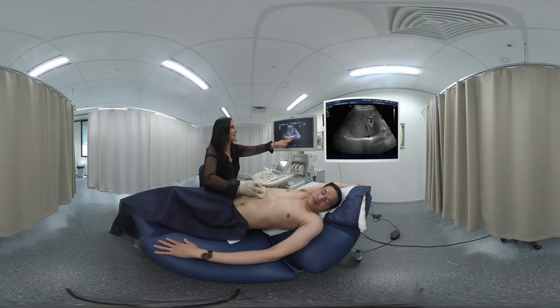Now in patient preparation, once again we should all know, patient fasting for 6 to 8 hours, have a few sips of water, don't restrict yourself too much. Diabetic patients need to be booked first thing in the morning, obviously, and also children will be booked first thing in the morning also. Now patients need to refrain from smoking and also from chewing gum, as that instills bowel gas, which causes dirty shadowing over our liver.